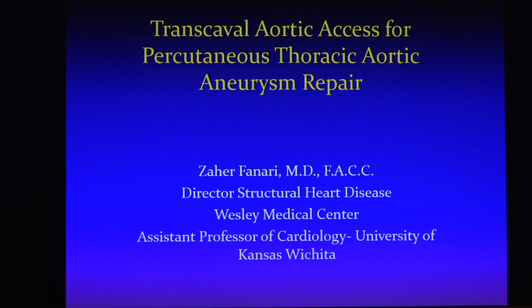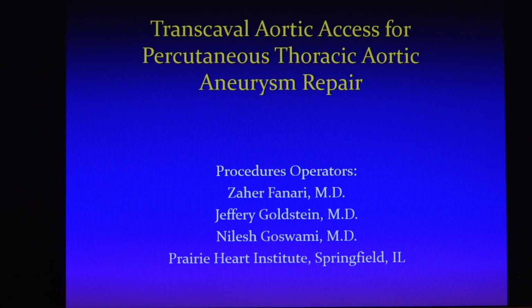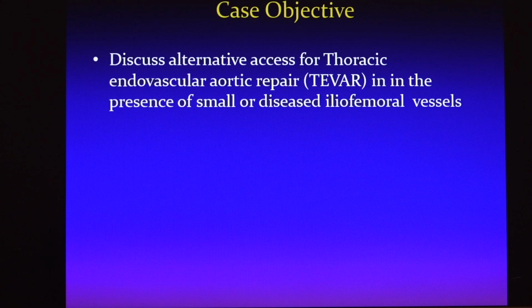It's very exciting to present this case. So today I'm going to talk about this special case where we did transcaval access to perform thoracic aortic aneurysm repair. These are my co-operators in the procedure. The case objective is to discuss alternative access for thoracic endovascular aortic repair, TEVAR, if you have a very diseased, small, or occluded iliofemoral system.